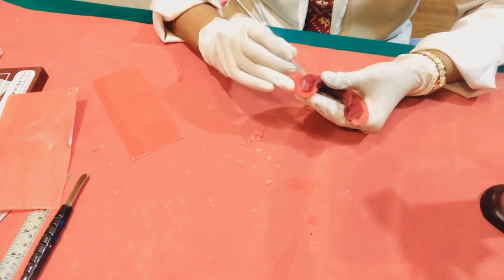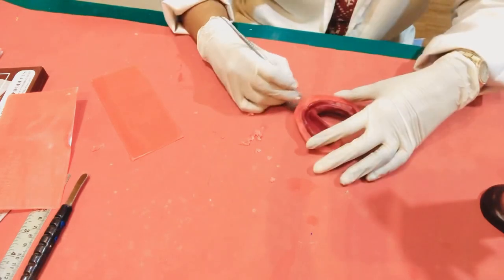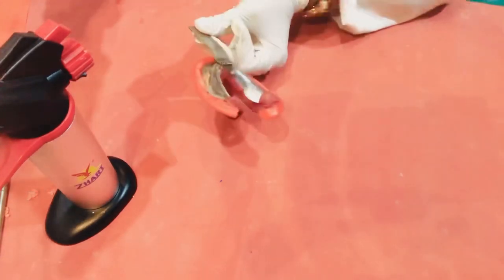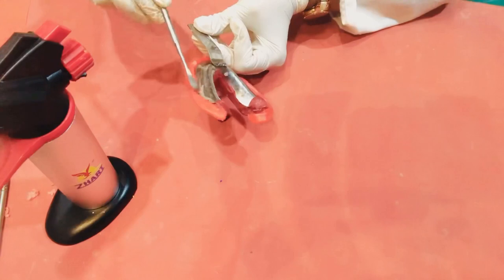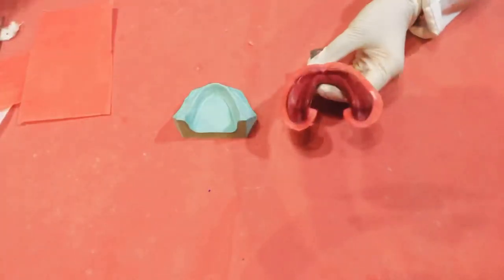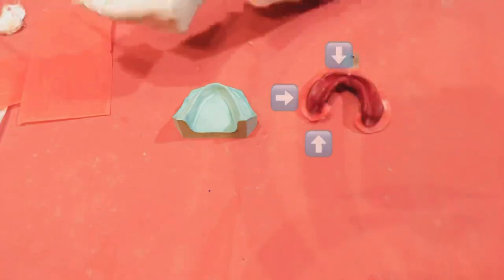You can remove any excess of wax and contour it with a lecron carver or seal the beading wax from both the sides. You can see that I've completed the beading on the labial, buccal and around the retromolar pad area.